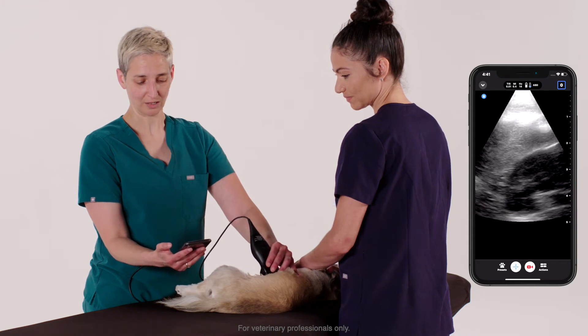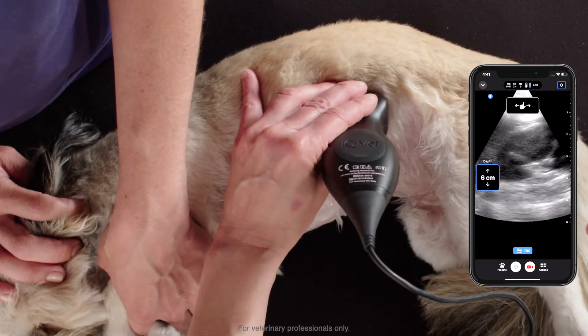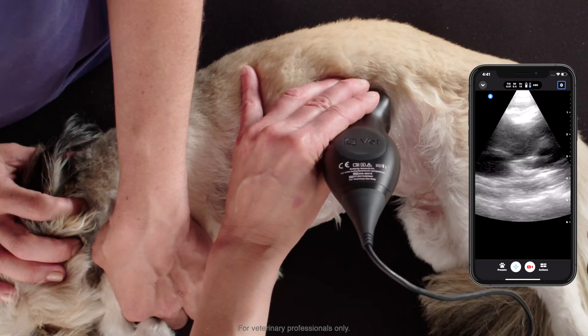There's none there. I'm bringing the probe a little bit caudal and we've got the kidney in view, just looking really for any evidence of perirenal effusion or any gross dilation of the renal pelvis.